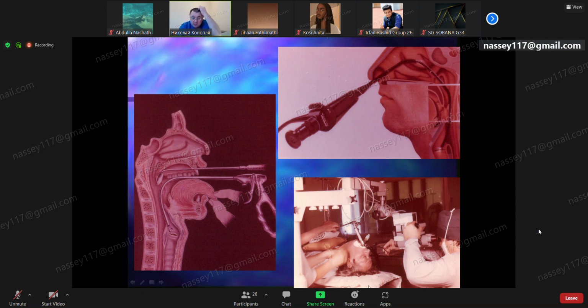Direct laryngoscopy is done with the patient under general anesthesia. Here you can see we insert the laryngoscope and fix it on the chest of the patient. Additionally we can use a microscope, or an endoscope, a hard rigid scope, inserted through this laryngoscope, and with special forceps we can remove this fibroma. But we must be careful, because if we remove too much, we can remove the fibroma together with the mucosa of the vocal cord, and we can get deformation of the vocal cord. The patient will have hoarseness of the voice after the operation, but due to another cause.